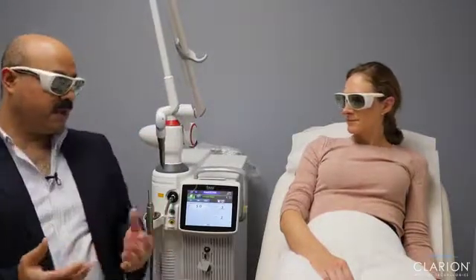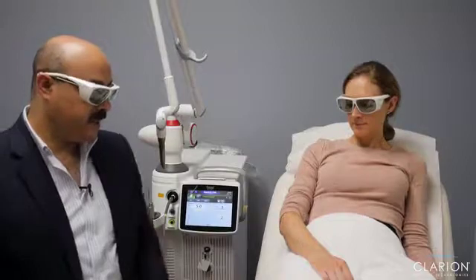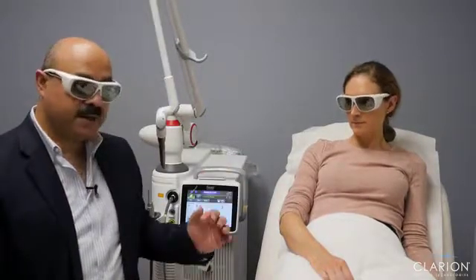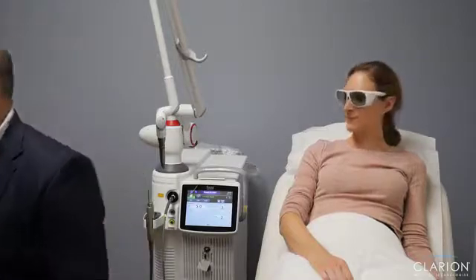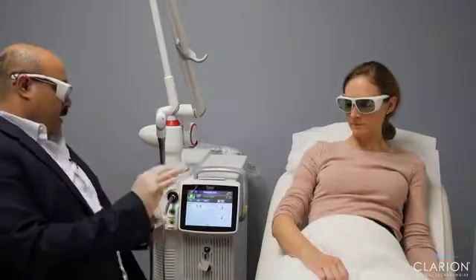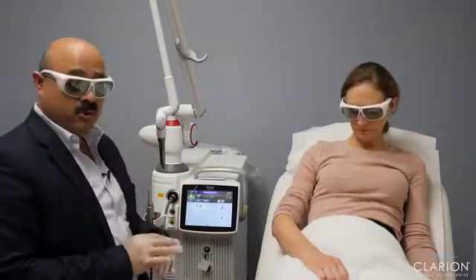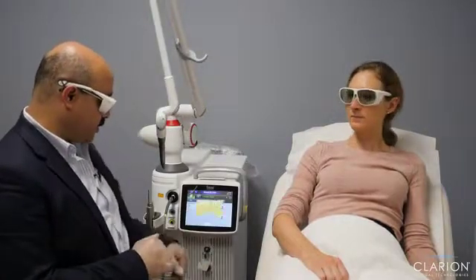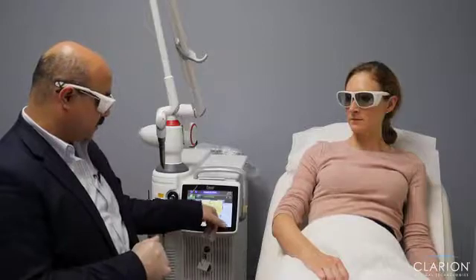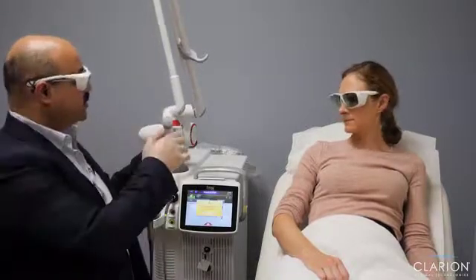I have to wear my gloves. We have to make sure that the skin is cleaned well. The patient is wearing the goggle. I am wearing the goggle. So we are going to start in a minute. So we are ready to go. The machine is set. We just need to put it on ready. We confirm that we are using the right spot size.